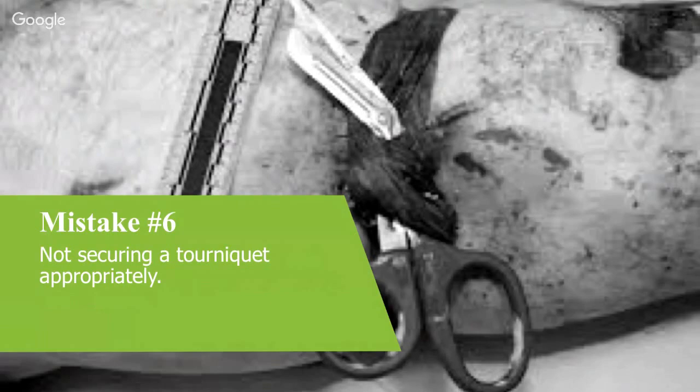With the commercially available stuff, I've seen a failure with a CAT. I've seen it many times in training, and once in real time, where with the CAT tourniquet, because now we single loop it, and the newer generations of CATs don't have the opportunity to double buckle it, because it was proven not required. When you just tighten up the strap before you've tightened the windlass, it's just hanging on its Velcro. And even after you've tightened the windlass, it's still hanging on that Velcro. And if you pull the tail of that Velcro open, if it's not secured properly, you're going to lose all the tension on your tourniquet. It's going to become ineffective and fail.